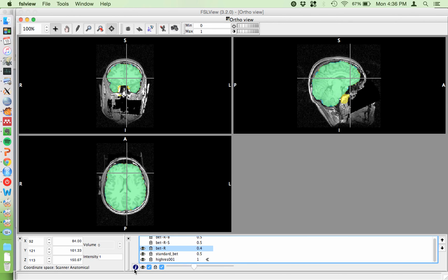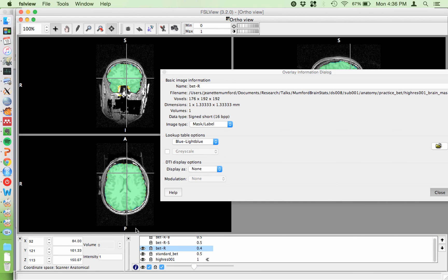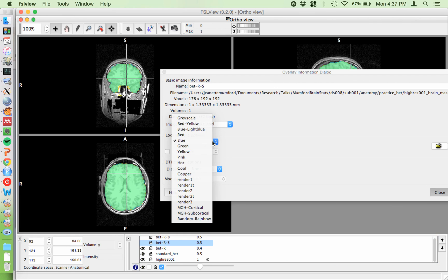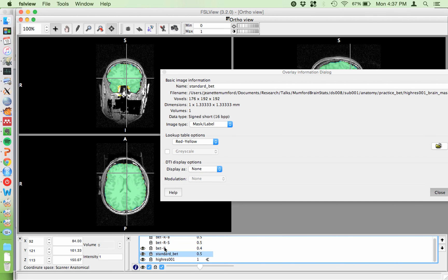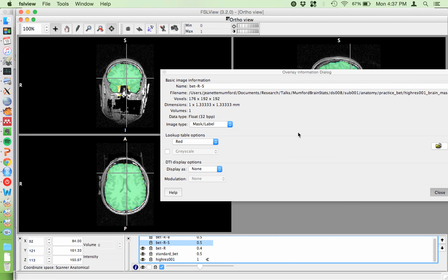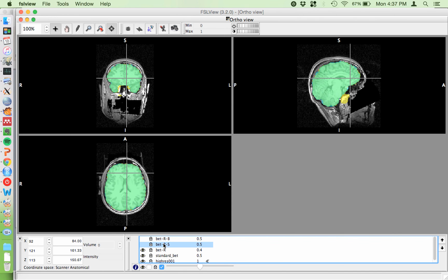A tip: if you hit the letter I, you can change the display name of the image in FSLview. It won't change the actual file, but it'll change how it's displayed. Another trick — if you want to move to a different image, you don't have to close the window. You can just click on it in the list and change whatever you want, like the color. This is nice for when you load a bunch of things into FSLview and want to keep things straight, for example overlaying multiple thresh ZSTAT1 images on the same brain.